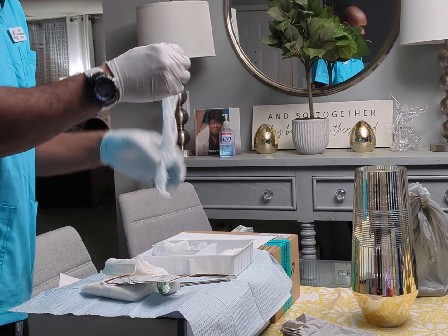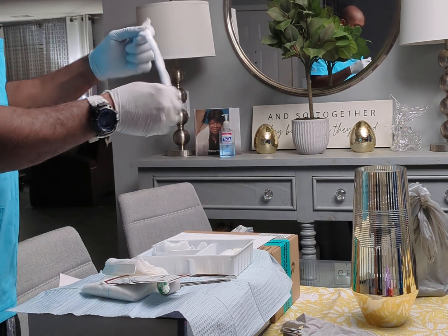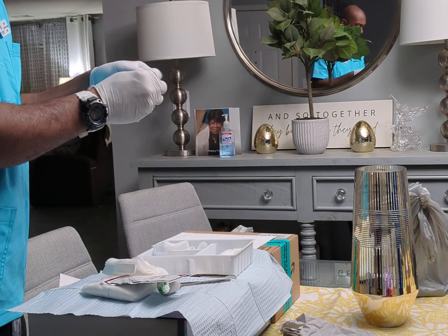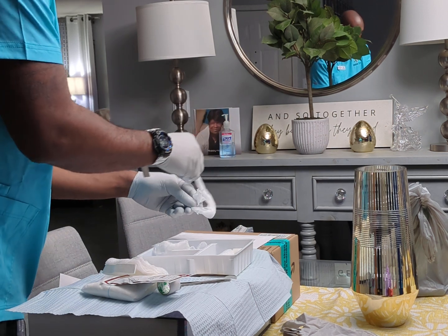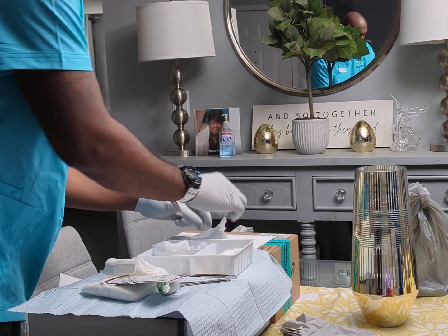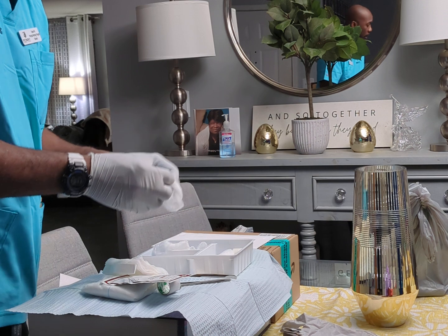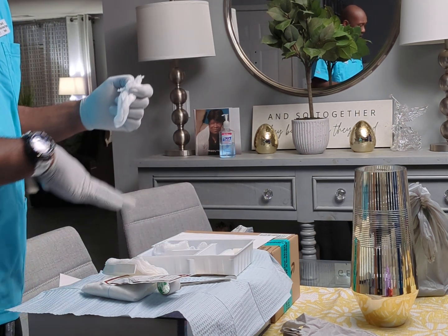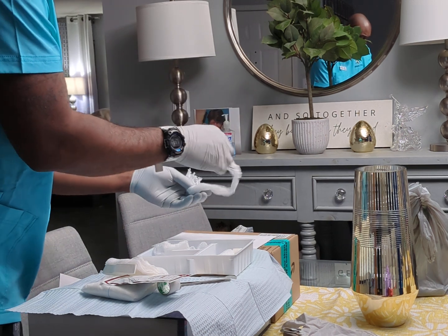So what we're going to do is get our dressing, fit enough so that we can put it into our wound. Again, we start in the middle and circle it around until the wound is packed. If we need some more, we'll cut another piece. Same thing, dry it out, make sure it's not dripping, make sure we don't drip anything on our sterile field, and we'll put that in there as well.